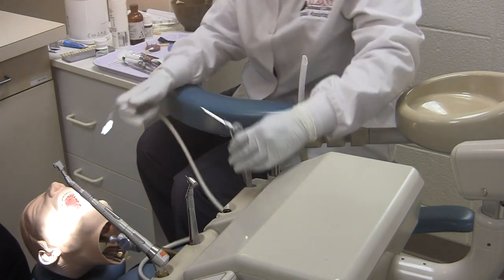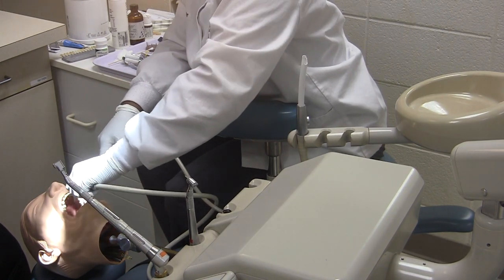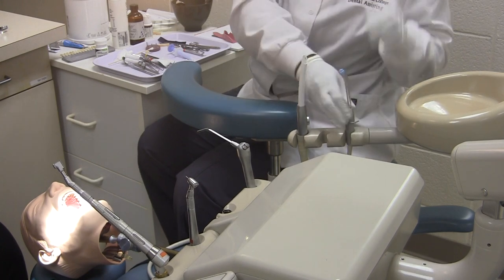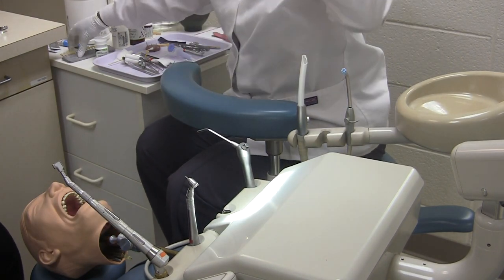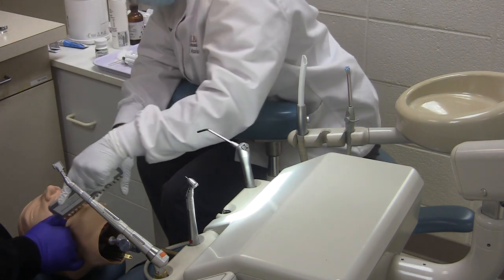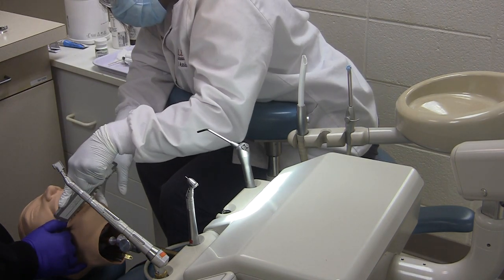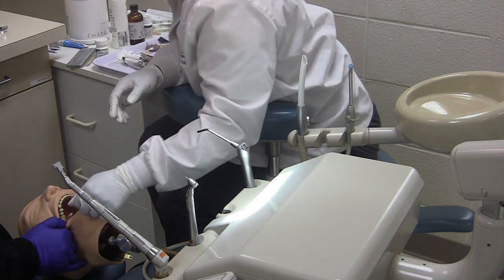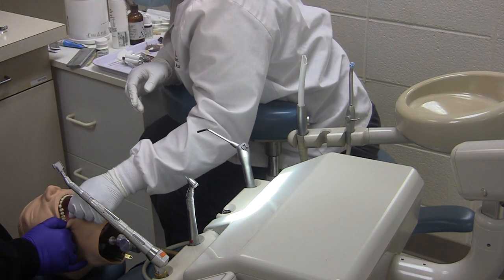Perform a full mouth rinse while the anesthetic takes effect. The assistant will then get a preliminary shade and always get the dentist to approve the final shade. Looks good.